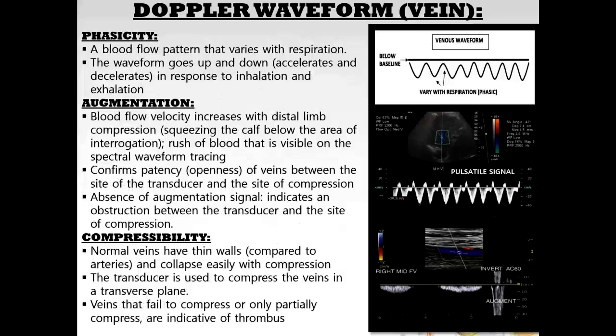Phasicity. So this is the normal flow pattern for a vein, and this is a blood flow pattern that varies with respiration. So the waveform is going to go up and down, accelerate and decelerate in response to breathing, to inhalation and exhalation.